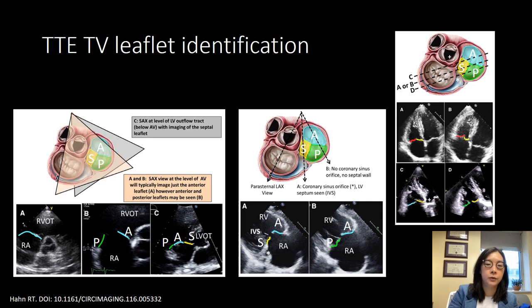In an RV inflow view where you can see two leaflets, if you see a coronary sinus, then you're looking at the septal as well as the anterior leaflet. If you've angled so you don't see the coronary sinus, then you're looking at the posterior leaflet and the anterior leaflet. In a four-chamber view, it's very hard without surrounding structures to know where you're looking — it could be the septal and anterior or septal and posterior leaflets. However, if you're tilted anteriorly and you see the aortic root or LV outflow tract, then you know you're cutting through the septal and anterior leaflet. If you've tilted back and you see the coronary sinus, you know you're cutting through the septal and posterior leaflets.